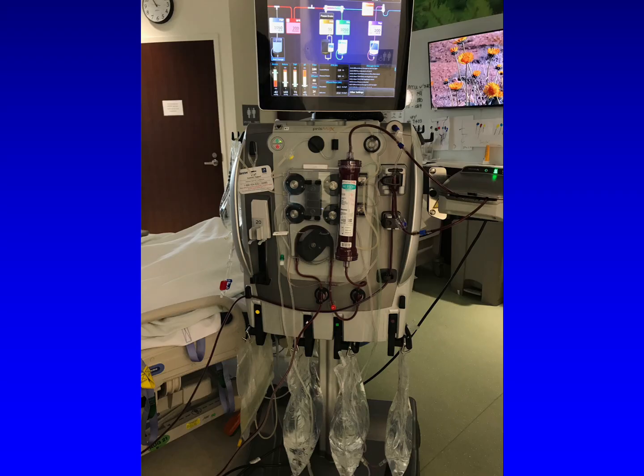Here's how a CVVH machine looks. Again, we have the patient's blood running through the hemofilter with the rate controlled by a roller pump. Ultrafiltrate is collected in one bag. Notice it has a little yellow tinge to it because it's plasma that's being ultrafiltered. And then we have replacement fluid being infused both before the filter and after the filter, and dialysate as well.